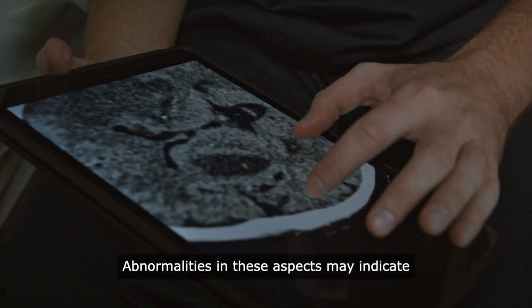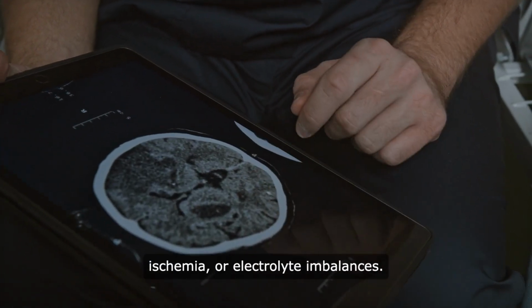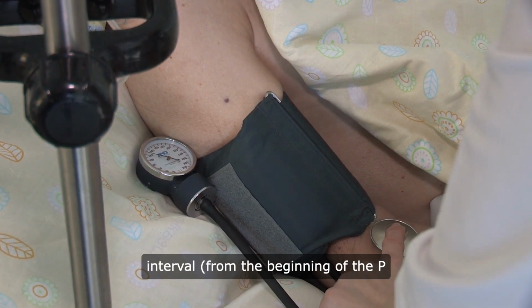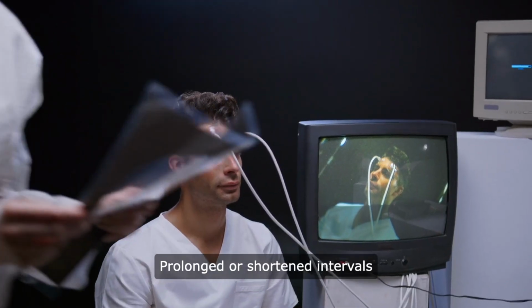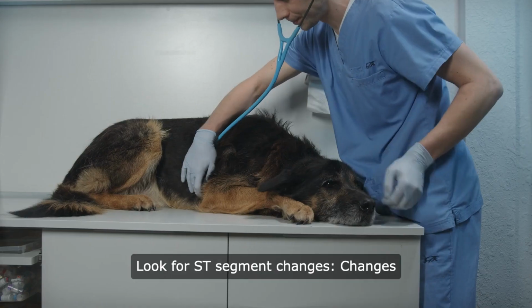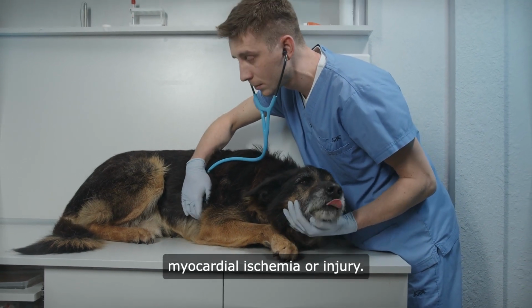Abnormalities in these aspects may indicate heart conditions such as arrhythmias, ischemia, or electrolyte imbalances. Check for intervals. Assess the PR interval, from the beginning of the P wave to the beginning of the QRS complex, and the QT interval, from the beginning of the QRS complex to the end of the T wave. Prolonged or shortened intervals can indicate certain cardiac conditions. Look for ST segment changes. Changes in the ST segment can indicate myocardial ischemia or injury.